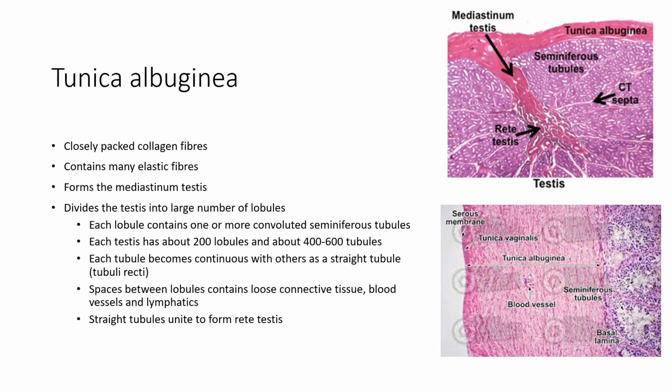It's very dense fibrous tissue. It is made up of collagen fibers and of course some components of elastic fibers. I'm very intentional in trying to use histology slides to show you, because I know several of you are going to be working on histology of the testis, and you are supposed to actually be able to appreciate your slides when you see them, be able to identify some of these components and know what exactly they are meant for. So you have the presence of collagen fibers, you have elastic fibers, you have also the tunica albuginea.